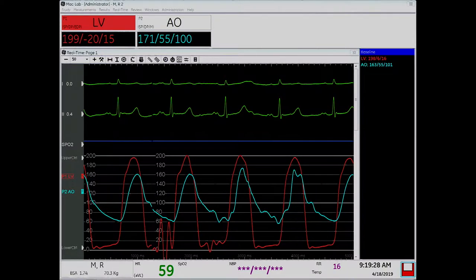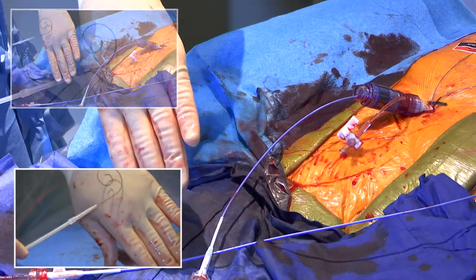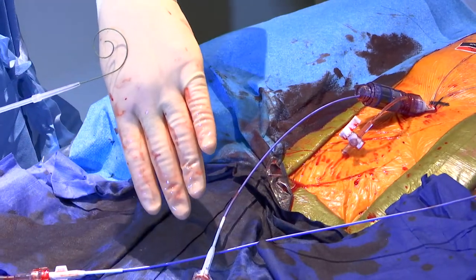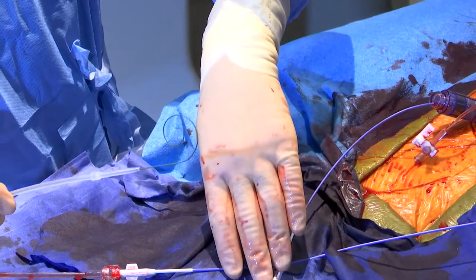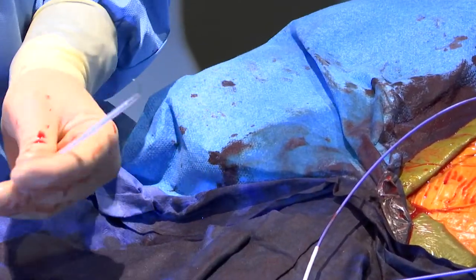Let's see, camera. Okay. All right, so there's my hand. You see the wire has got a nice bend to it. It looks like a pig's tail. And I'm gonna put that in the ventricle.